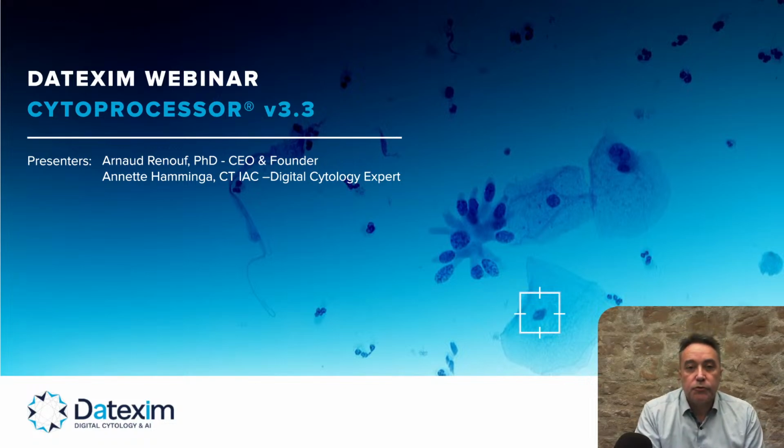We will present to you today CytoProcessor version 3.3, our latest release. I'm the CEO and founder of the company, and I'm today with our digital cytology expert, who will do a demonstration of this version live after a few slides that I will present.